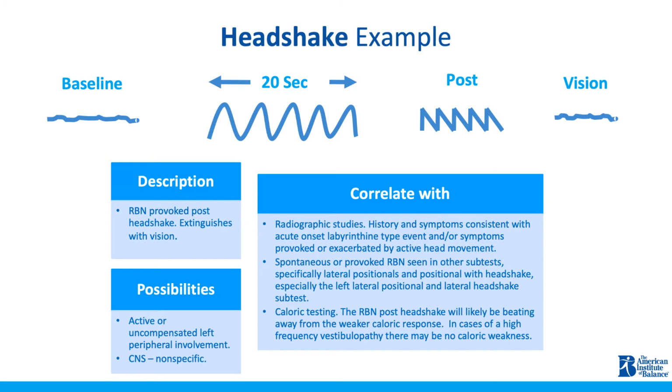The VNG test is typically completed after posturography, and the high-frequency headshake within the VNG is completed after ocular motor testing, spontaneous and eccentric gaze testing, and after the rotary chair test if it is available.